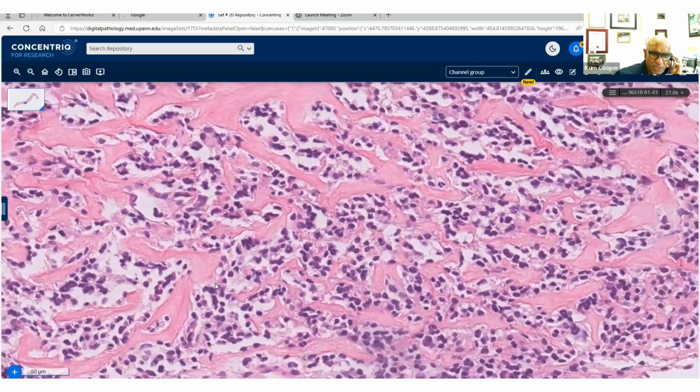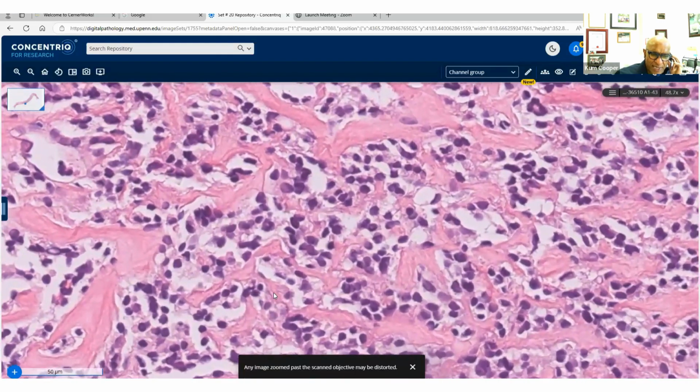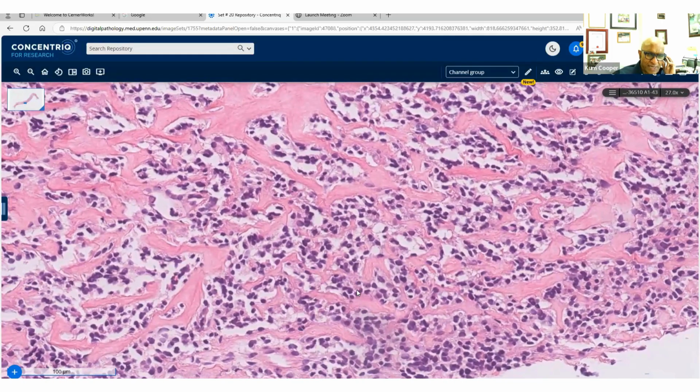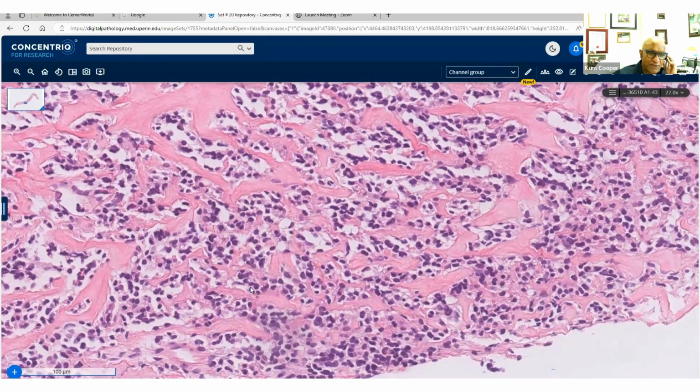The suggestion of PEComa is an excellent one. Before I usually get to PEComa, I always ask myself, what else could this be? Other tumors that come to mind would be the uterine tumor resembling ovarian sex cord tumor. That's another tumor that has to be given consideration. The cords and nests are a good feature of that. They can be sheet-like. They can even form glands. For that, you need epithelial, mesenchymal, as well as sex cord markers to be positive.